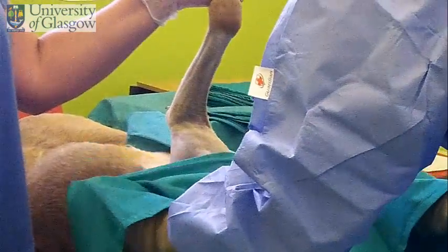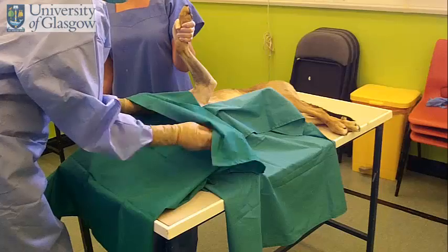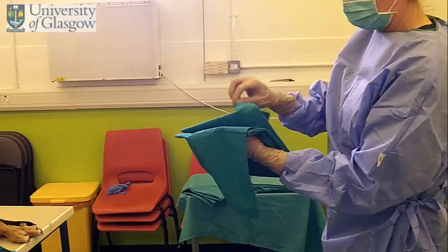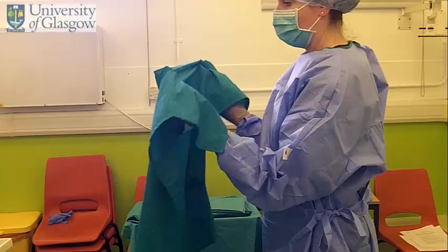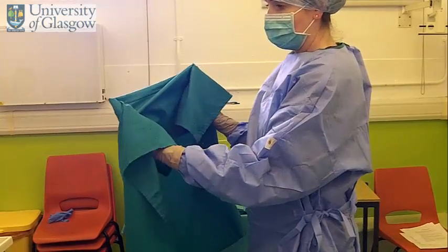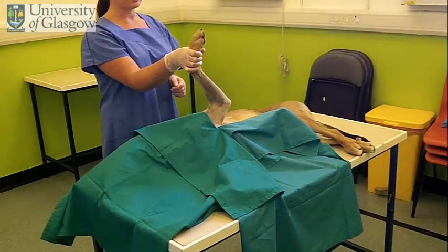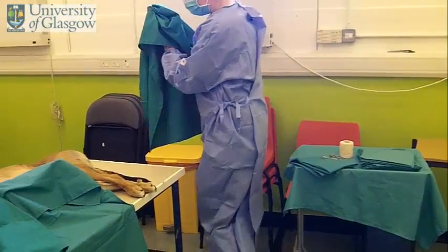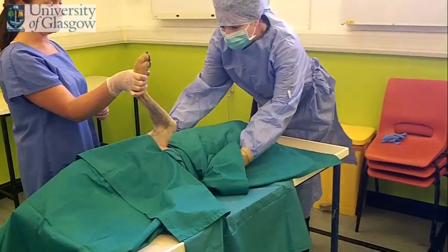Drape the limb. Bring back your third drape. Same method, roll your hands to protect it. Because your assistant is standing there holding the limb, you're going to skip that draping area, and come caudal to the limb and place that drape. You want to hold the drape on itself. Come in this direction. Place the drape.